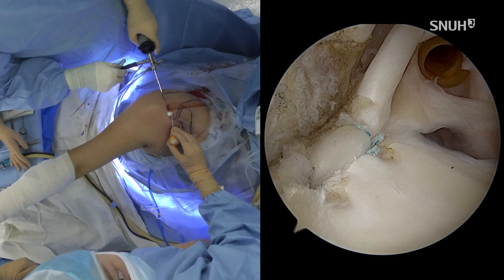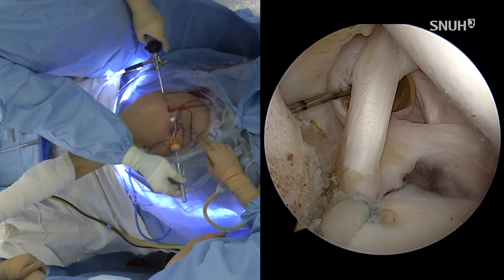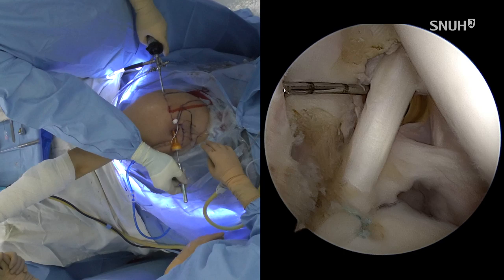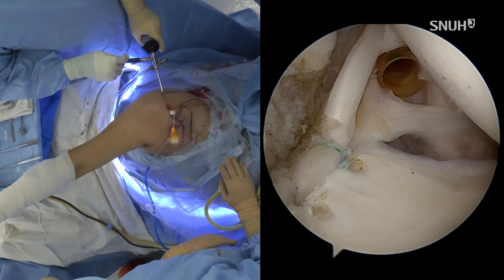So usually the transrotator cuff portal here is well healed. According to my paper, no partial tear has happened and no leakage after 1 year on CT arthrogram. So don't worry about tendon injury through the transrotator cuff portal, especially for young patients. Okay, this is the end of the surgery of the SLAP lesion with spinoglenoid ganglion cyst. Thank you.